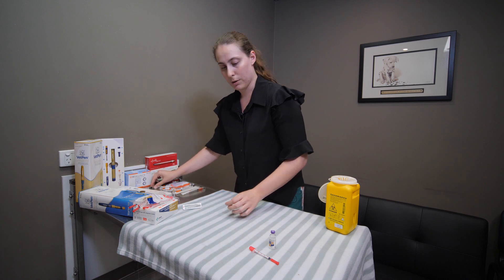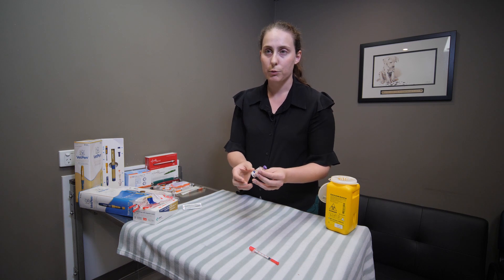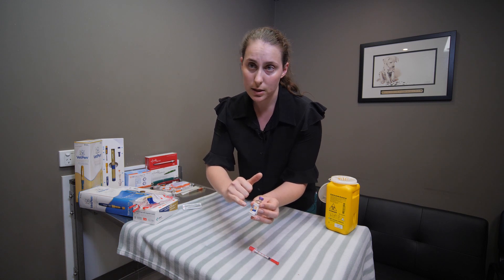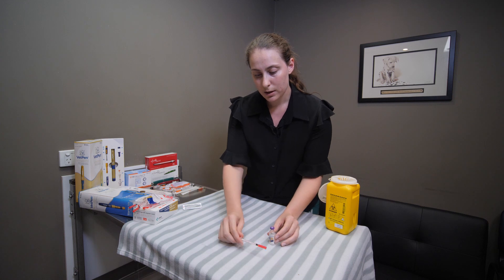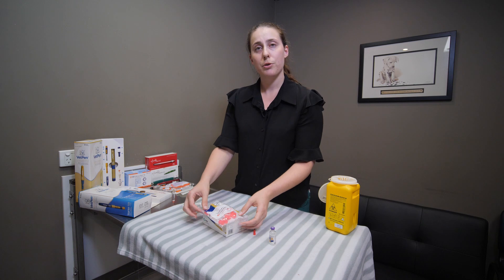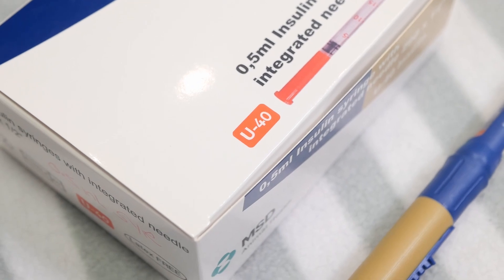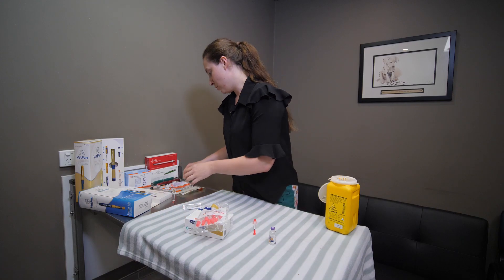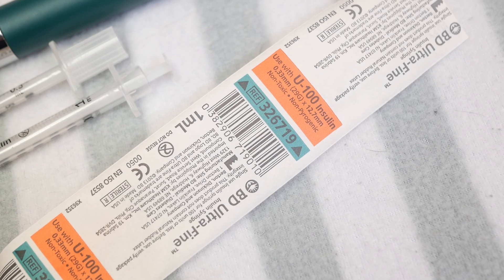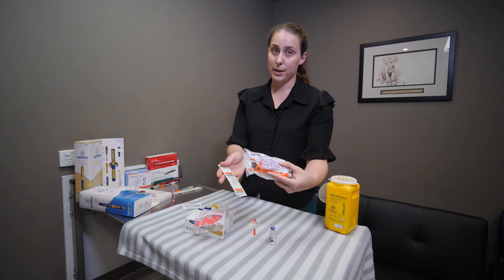Caninsulin is a U40 insulin — 40 units per mL — and you can see on the device it will say 40 IU or international units per mL. It's incredibly important to always match all of the implements you're using with a U40 product, which is usually clearly labeled on the packaging, sometimes in red. This is different to Humulin, which will say U100 on the packaging. Using the wrong syringe on the wrong product will give you the wrong dose.